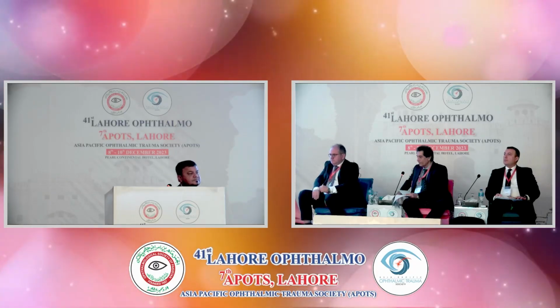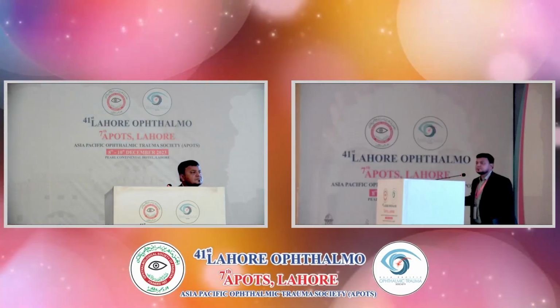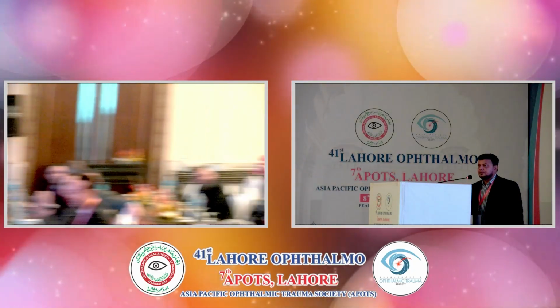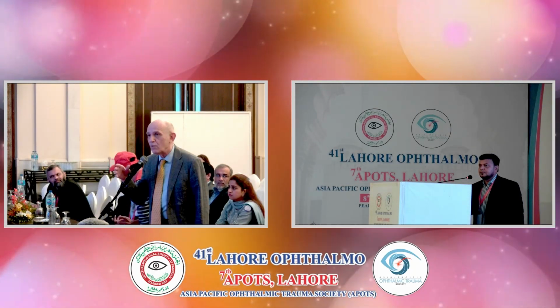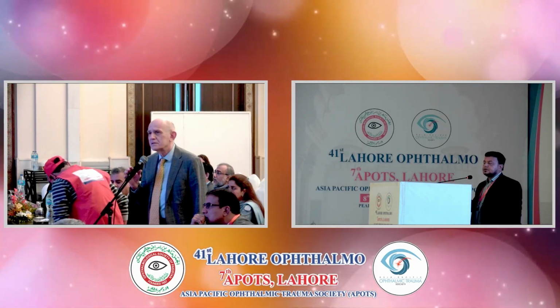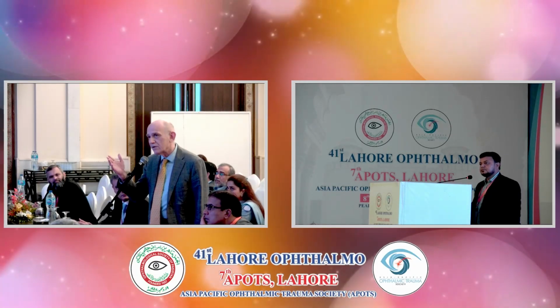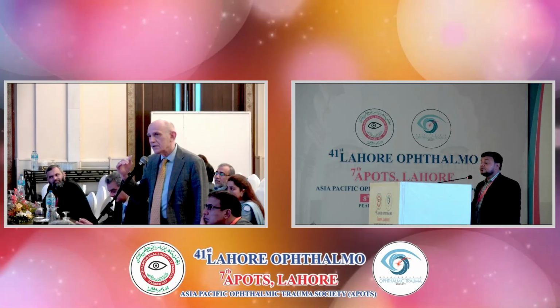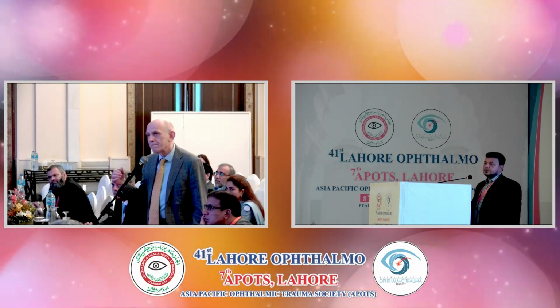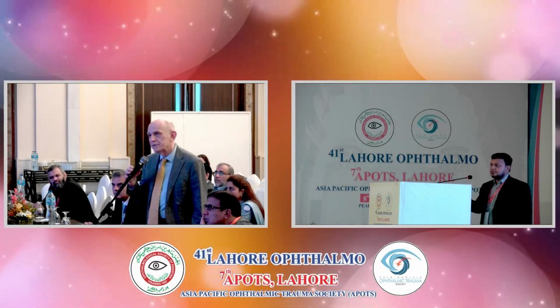In one of your slides, you have that you're using in primary repair a concentration of C3F8 at 20%. Now, 20%. Is that an error on the slide, or is that your technique, and if so, why? No, it is usually what we are using in the macular hole or all the gases. We use the usual 20%. But that would give you a higher, it's not isovolumetric. It's an expandable mixture if you use 20%. I use a mixture. I do not use the pure gas. And in our cases, the patient behaves well.